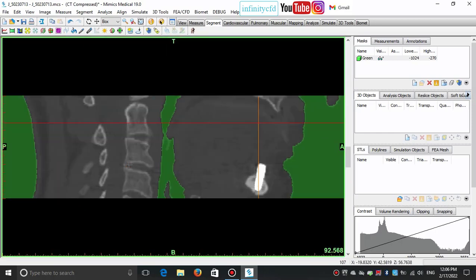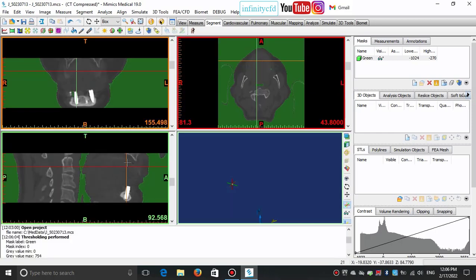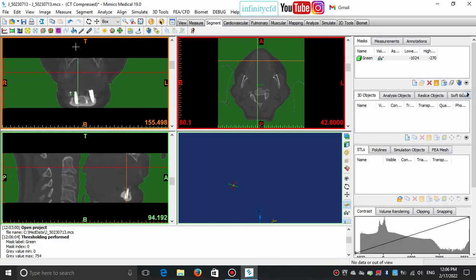For obtaining a better view and to distinguish different tissues, we can set the contrast values. We can change the contrast of the images by moving the line or the end points on the graph located in the contrast tab of project management.